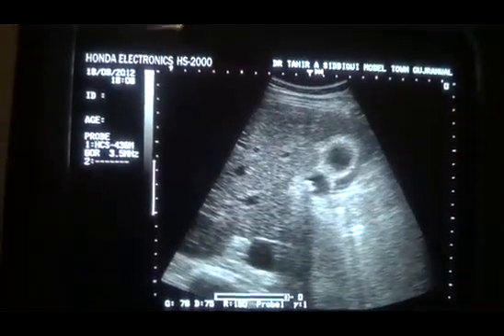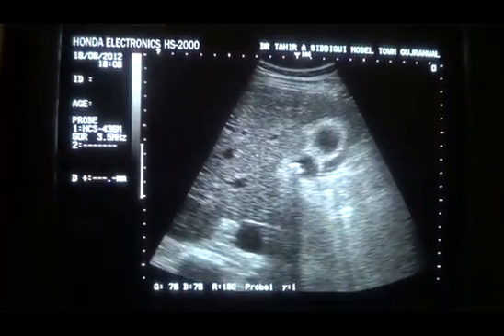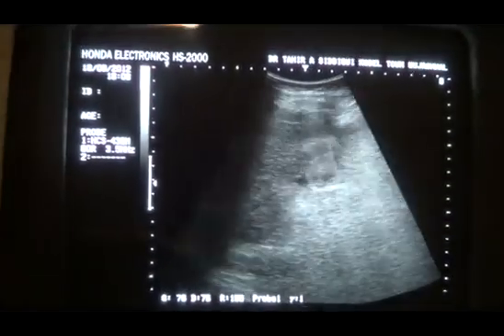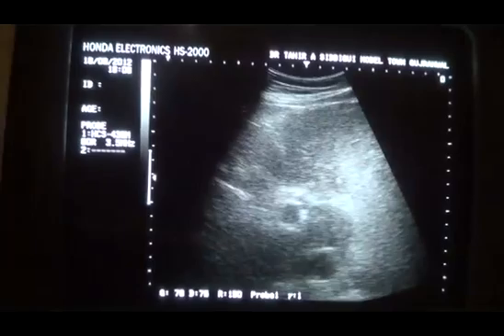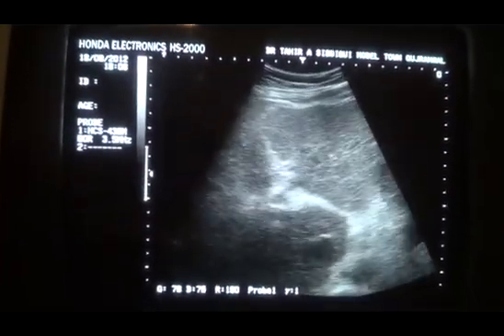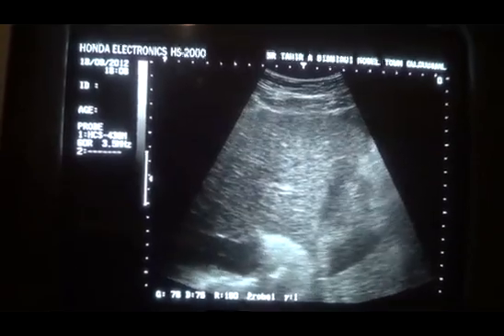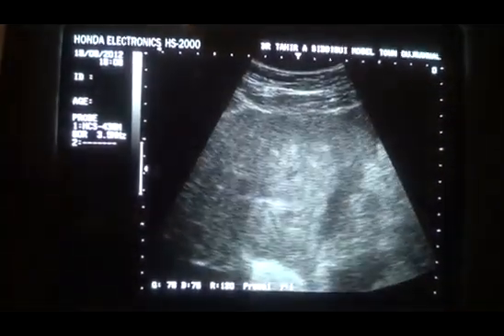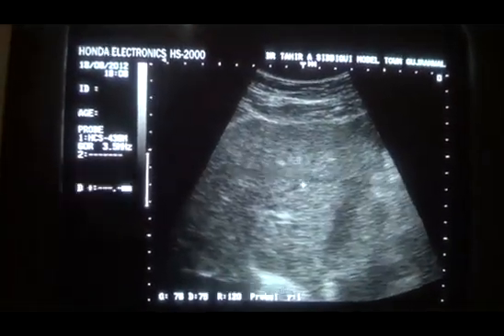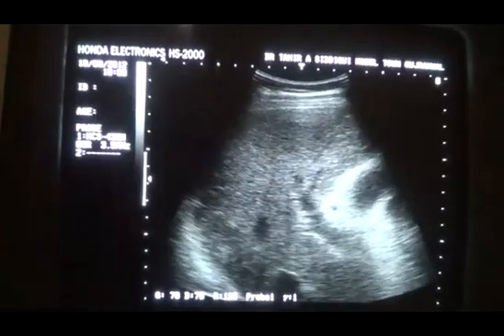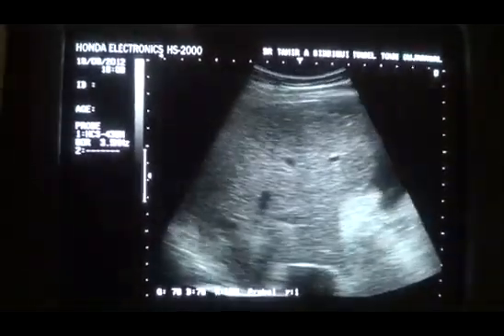This is the gallbladder. It contains a few calculi within it. This is the cirrhotic liver. You can see that the outer surface of the liver is irregular. This is the coarseness, this is the irregular outer surface. And there is ascitic fluid around the inferior surface of the liver.